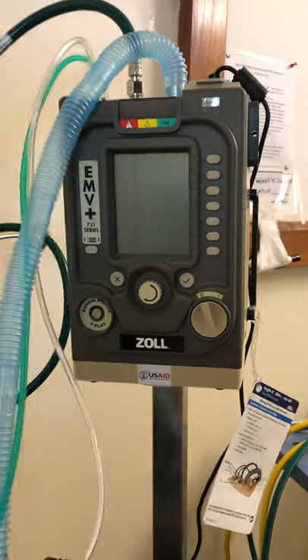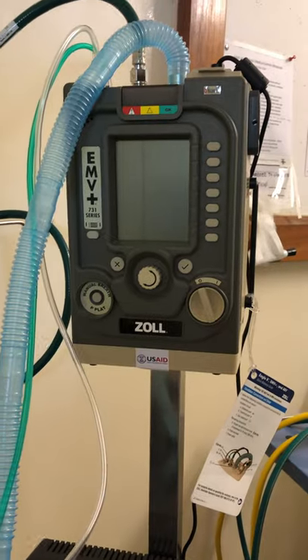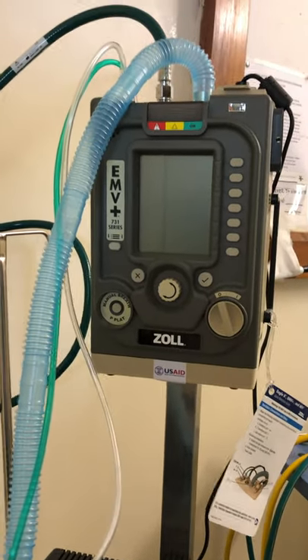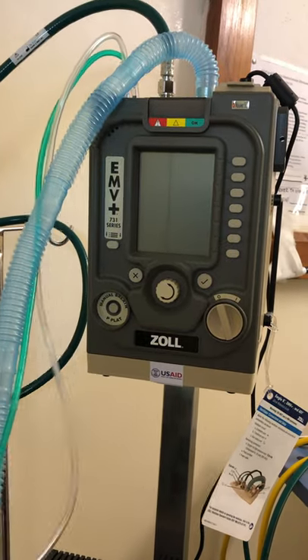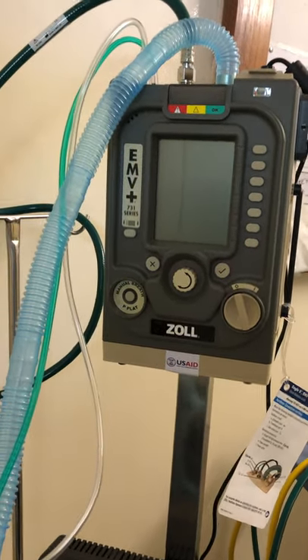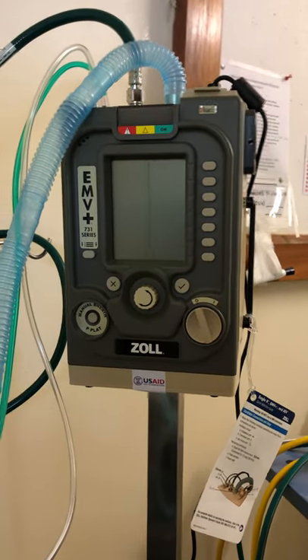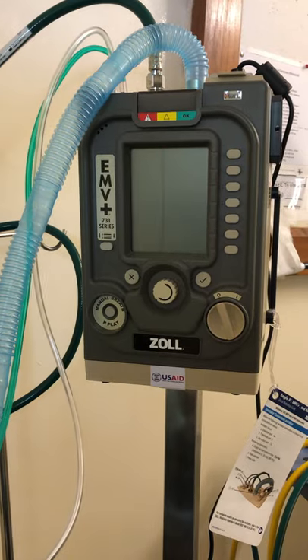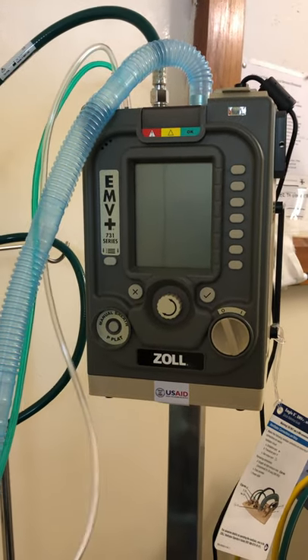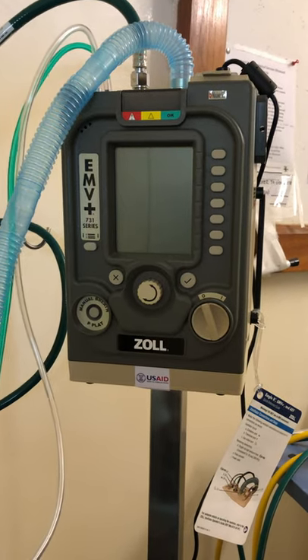Hey guys, we've gotten these new EMV Plus ZOL ventilators from USAID and we've already been using them. I just wanted to do a brief little instruction on how to use them. Like any ventilator, please be careful about what you're doing. If you're in doubt, call for help. If it's not working, call for help. Remember all those basic safety things.